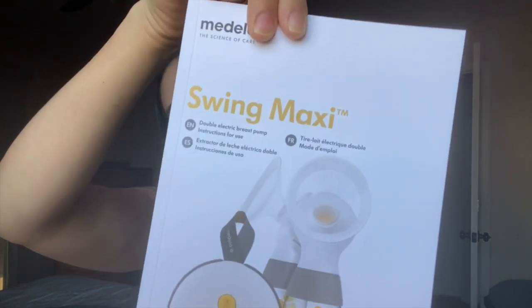The package came with extra cones, a bottle, and a holder so your milk doesn't spill. It also came with a bunch of extra pieces. I'll show you guys what the inside of the backpack looks like and then all the assembled pieces as well.